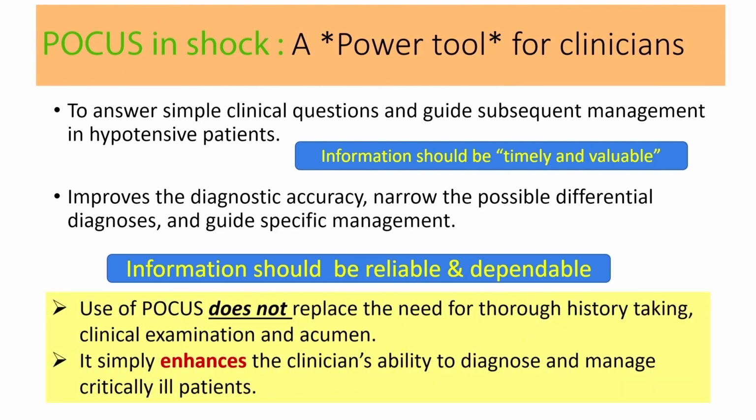But one should remember, it does not take away clinical examination and history taking. So that has to be the first thing. Ultrasound comes just as an add-on tool to enhance your decision making and diagnostic capacity.